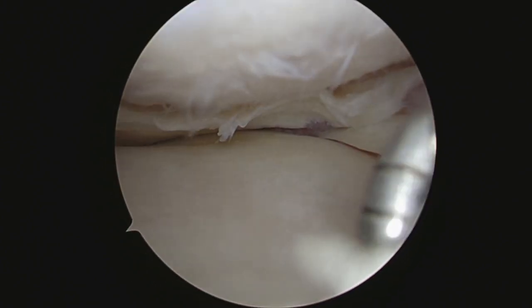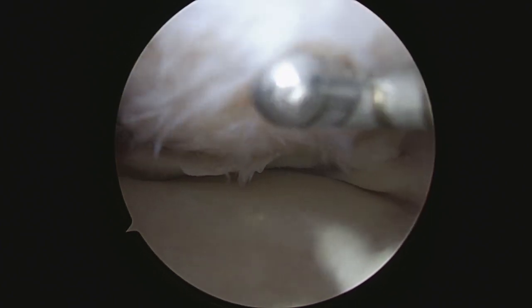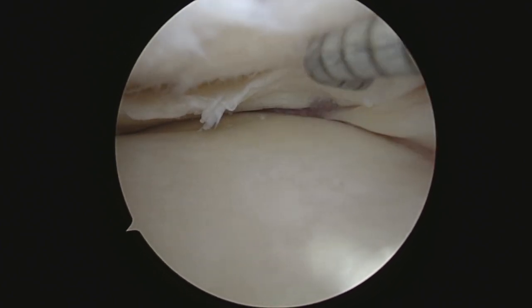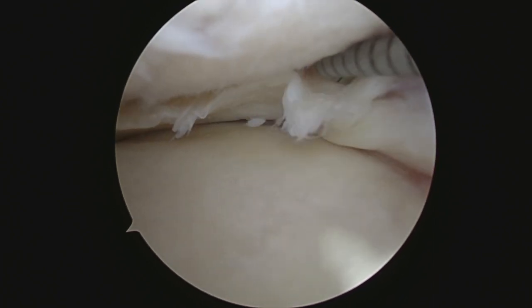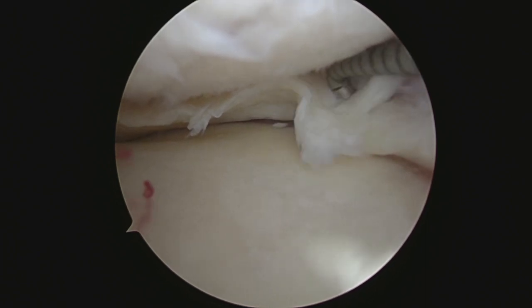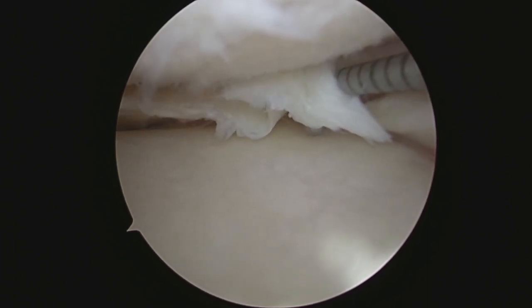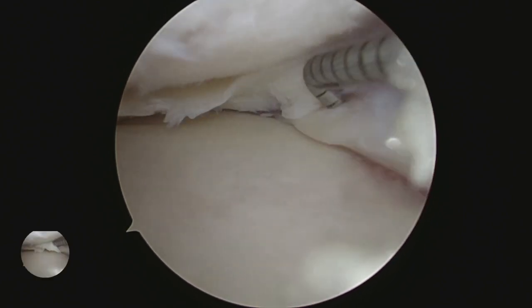Okay Roselle, so I have good news here. I'm on your inside compartment of your knee where your meniscus tears. You do have some arthritis at this area, but your meniscus tear is pretty bad, so I do expect you to have pretty good relief from this. It's good that it's bad, because it means that most likely you should have pretty significant relief from the pain. You could see as I just put the probe there - your meniscus is just completely torn. Unfortunately it means we'll have to take out a fair amount of it, but otherwise you should do pretty well with this.